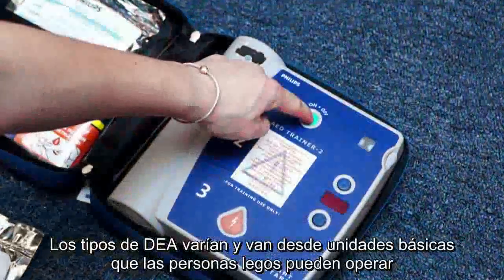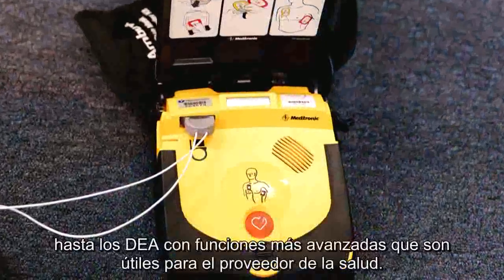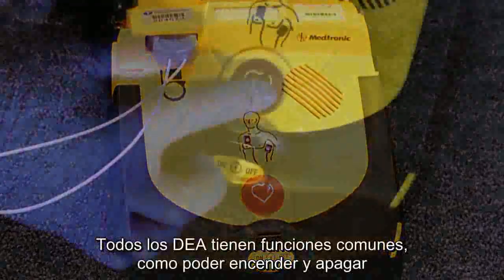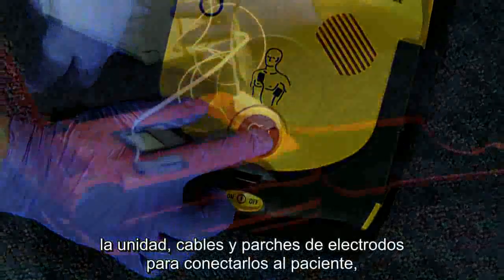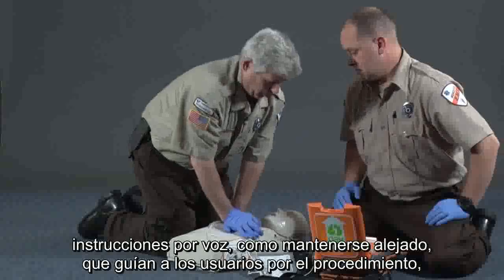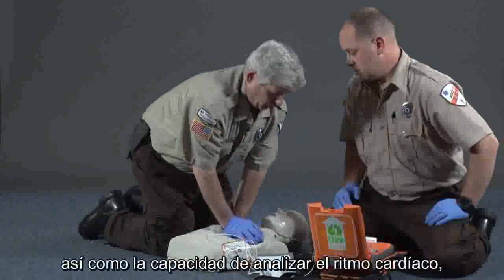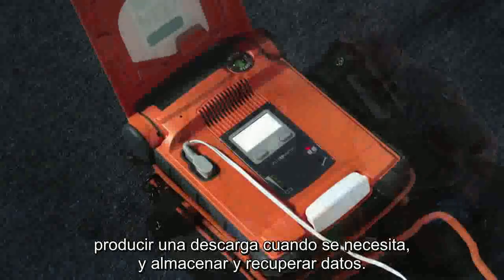Types of AEDs vary from basic units that laypeople can operate to AEDs that have more advanced features helpful to healthcare providers. All AEDs have common features, including the ability to turn the unit on and off, cables and electrode pads to attach to the patient, voice prompts such as "stand clear" to guide users through the procedure, and the capacity to analyze the heart rhythm, deliver a shock when needed, and store and retrieve data.